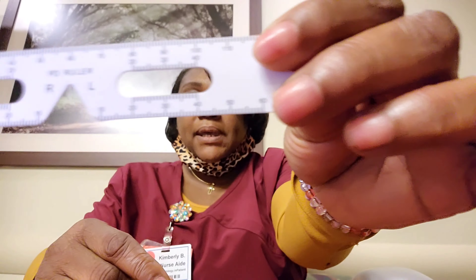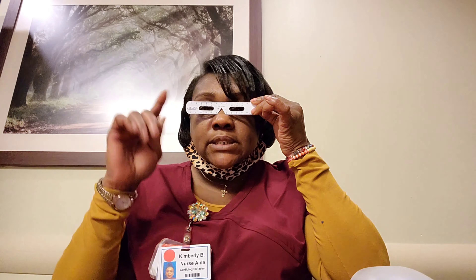It also comes along with a PD ruler to measure the distance of your eyes so that the prescription can be right where it belongs. Okay, so now let's look at the glasses that I got.